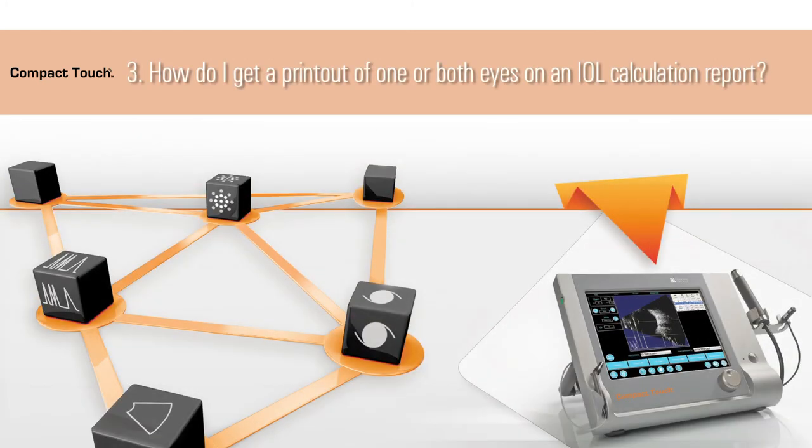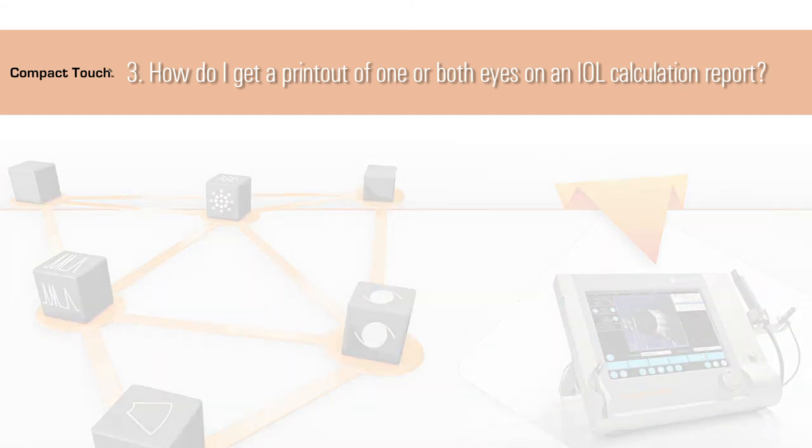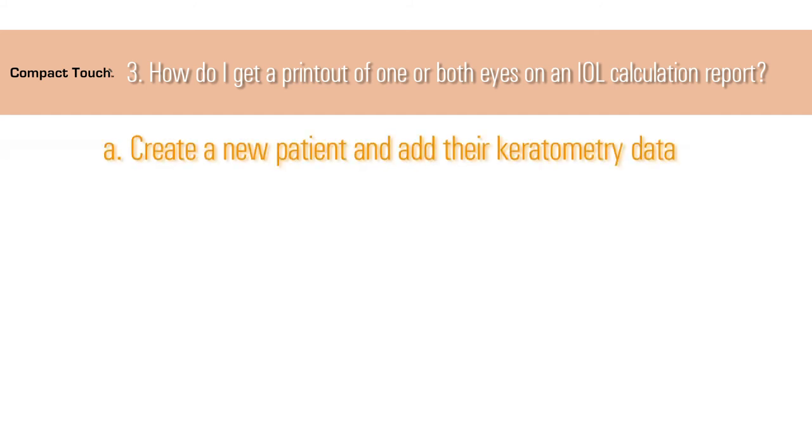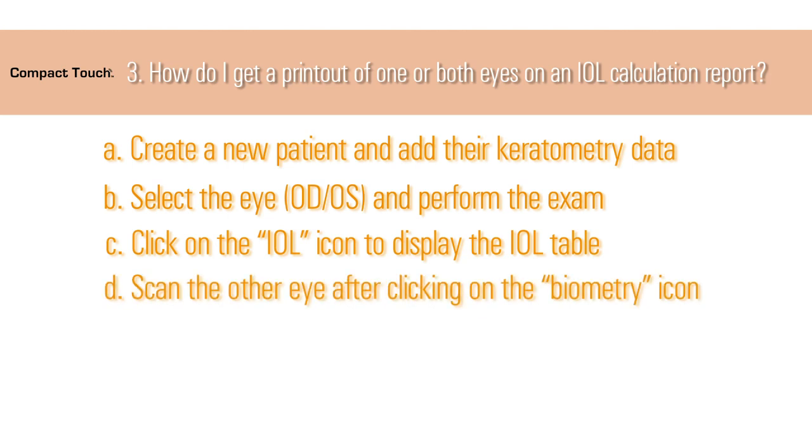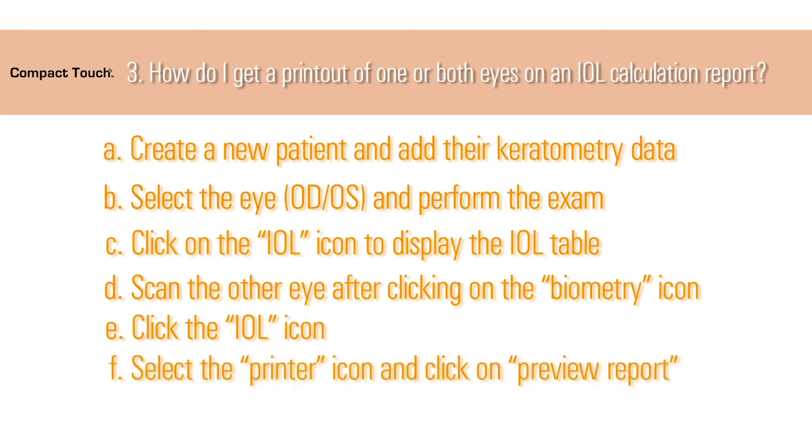3. How do I get a printout of one or both eyes on an IOL calculation report? First, create a new patient and add their keratometry data. Next, in the Biometry Exam page, select the eye (OD, OS) and perform the exam. Click on the IOL icon to display the IOL table. Scan the other eye after clicking on the Biometry icon. After measuring the second eye, click the IOL icon. Lastly, select the Printer icon and click on Preview Report.